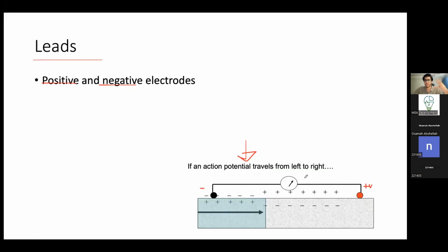And then they're going to measure the voltage difference between 2 points. That's all they are. That's all the leads are. They're measuring the voltage, or the electrical difference, between 2 points. You just need to know this.